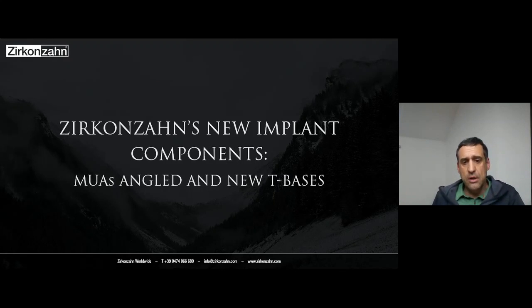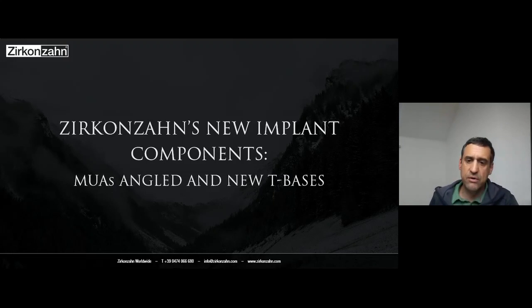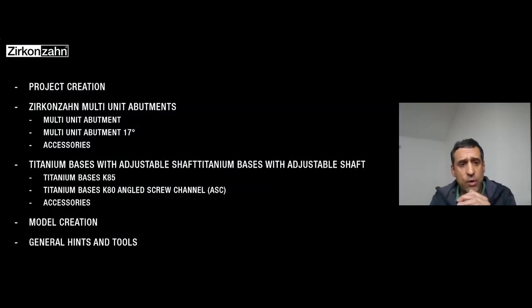Okay, so most of the presentation is based on the new components, meaning the MUAs, angulated, and the new T-bases. That's the focus of our live presentation today, and I will show you how to use it and how to implement it in your daily workflow.